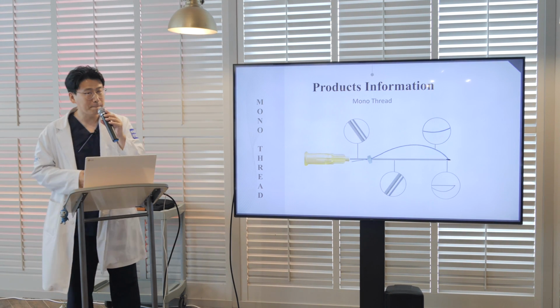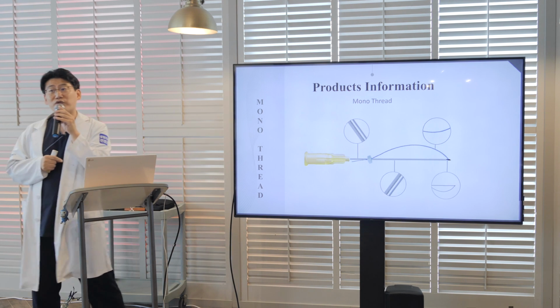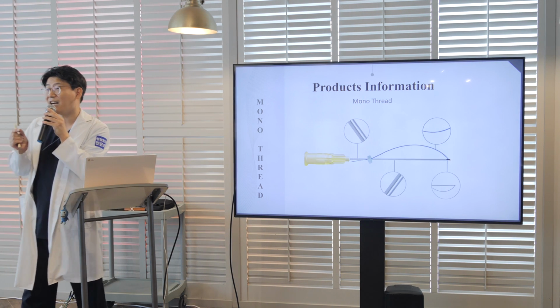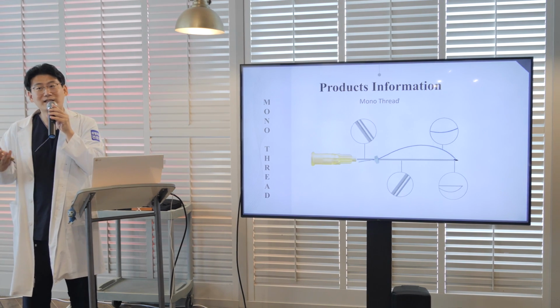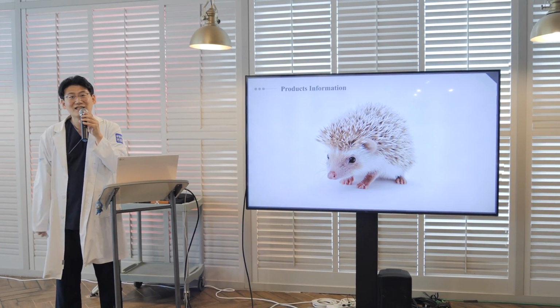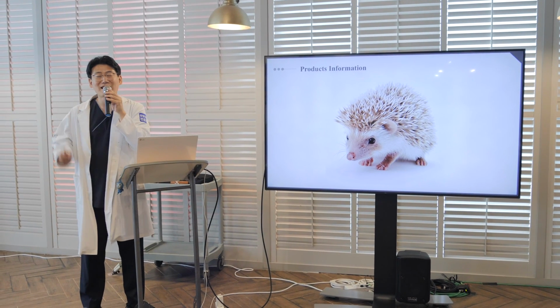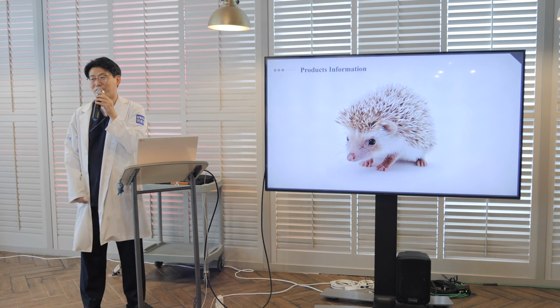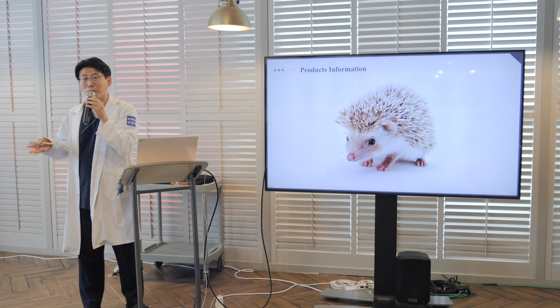Yes. Then if I want the effect with the mono thread, I should insert at least 100 threads on the patient's face. Then what will happen? The patient will be a hedgehog. So I should insert so many needles on the patient's face. It will cause swelling, bleeding, bruising.